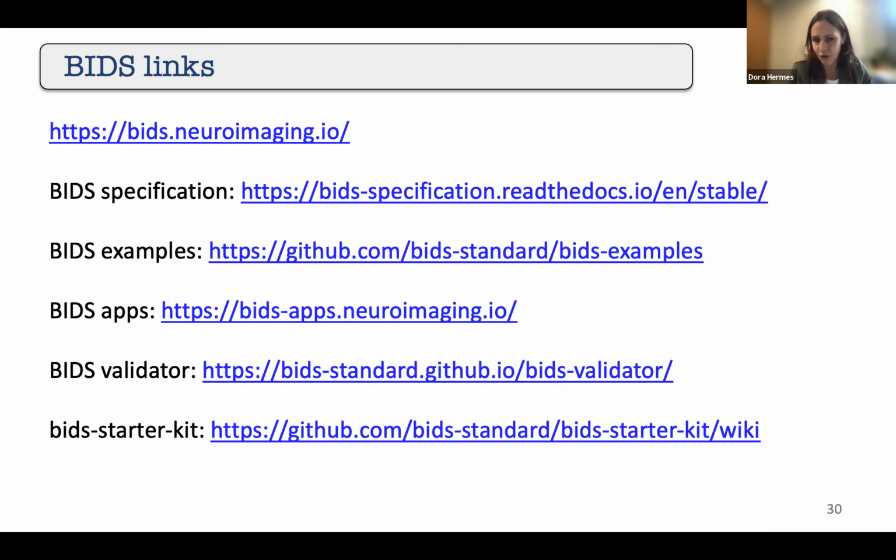For MRI, there are already a lot of templates available and standard procedures for automatically going from the DICOM files into the MRI extraction. Those tools are all highlighted in some of the BIDS apps, and this website also links some of the tools for MRI. But for intracranial EEG, as you saw before, that was not as straightforward, so we had to create those templates.